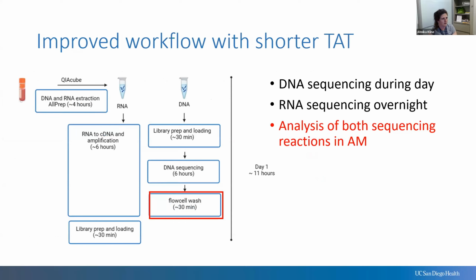Someone just put a text. Do we typically only use the pneumonia BioFire panel for BAL, or do we use it for other specimen types? Thank you, Hannah. The question is, we only use the pneumonia BioFire panel for BAL specimens. There is also a BioFire respiratory pathogen panel that is a nasopharyngeal swab. We do not typically do it from sputum, though I have known labs who have offline validated one or both of those panels for sputum.